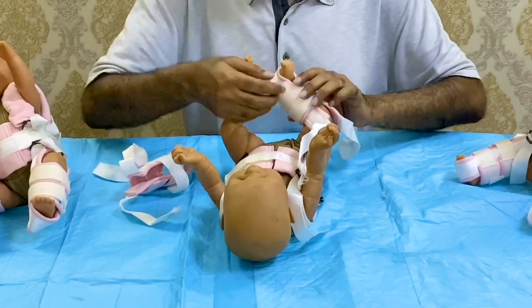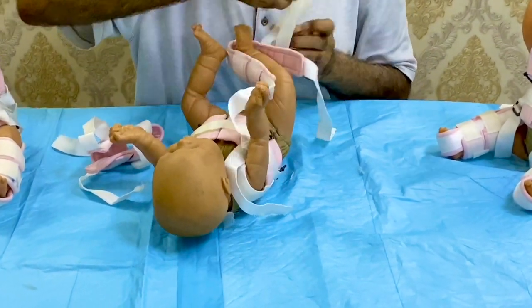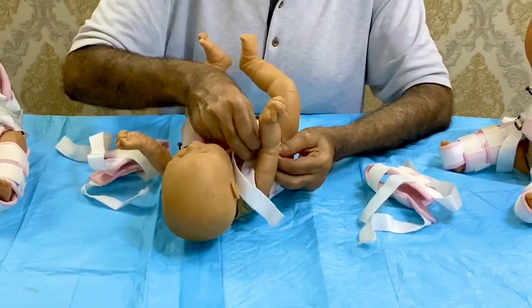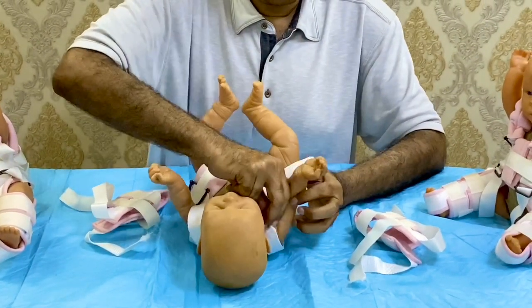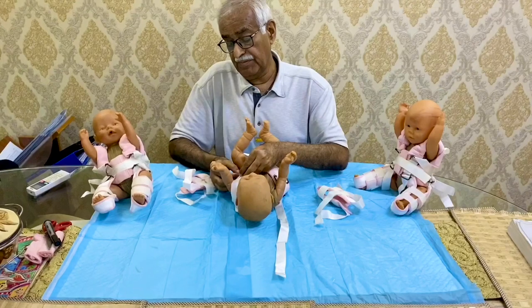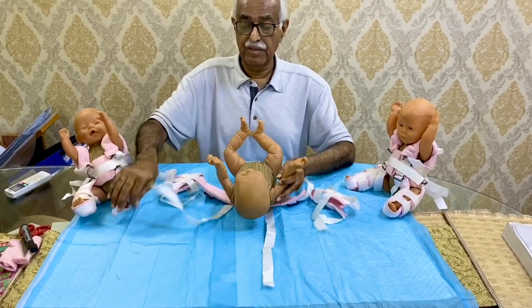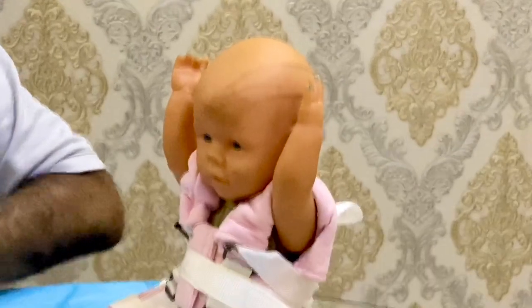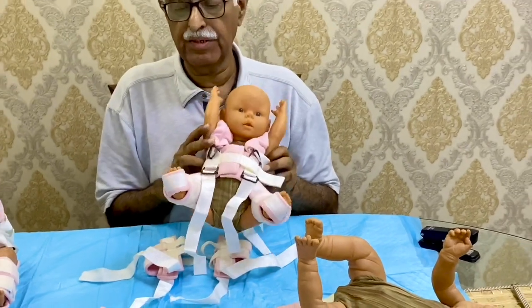You can also wash the straps whenever needed, because this is a four-month treatment. For the shoulder straps, you can do only removal of the shoulder straps, and then the baby is ready for the bath. Once the bath is done, put on seasonal clothes again and reapply the harness. This is another baby with a Pavlik harness already applied.